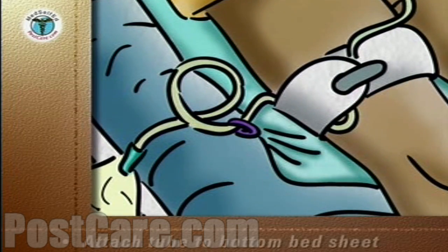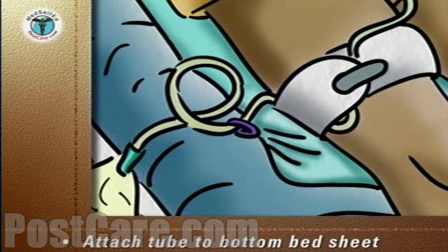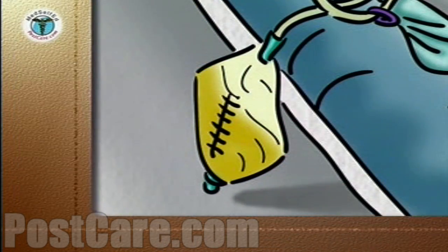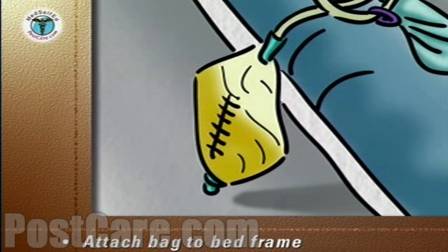The drainage tube should be attached to the bottom bed sheet by a fabric tie around the tubes and a safety pin, or by a clip if one is provided. The drainage bag can be attached to the bed frame, should never touch the floor, and should always be kept below the level of the patient's bladder.